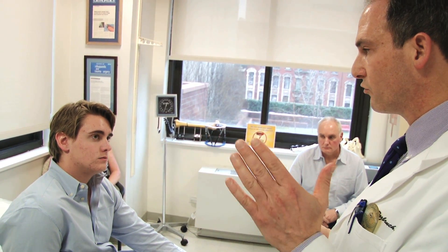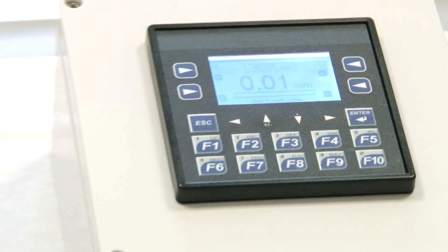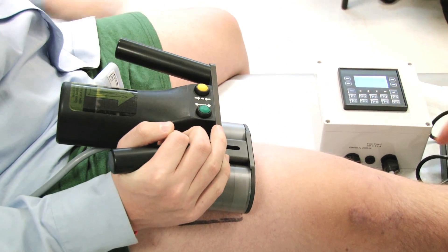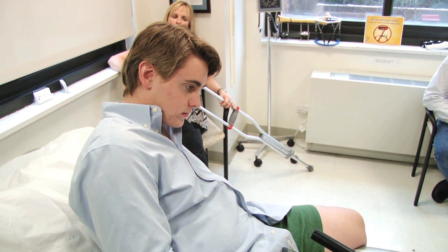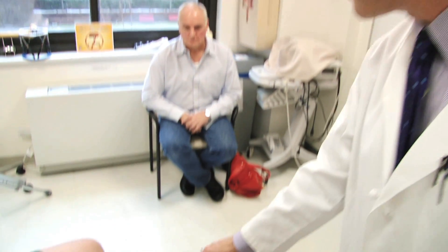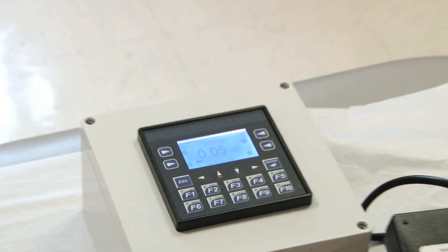It's really important that when you do the treatment, you do it regularly and space it out nicely — first thing in the morning, in the middle of the day, and at the end of the day. What you're hearing is the rotation of the magnet, and what you're actually seeing in real time is how much lengthening is happening. It's gradually happening, and over the course of two minutes and 20 seconds it'll achieve a third of a millimeter.